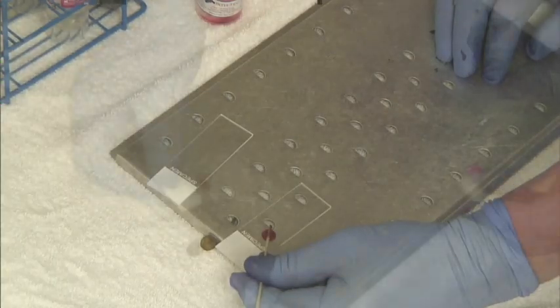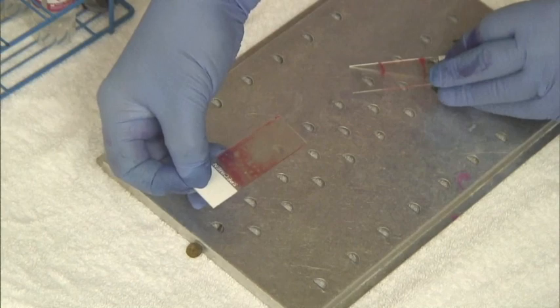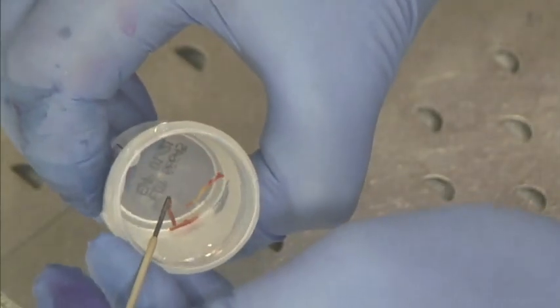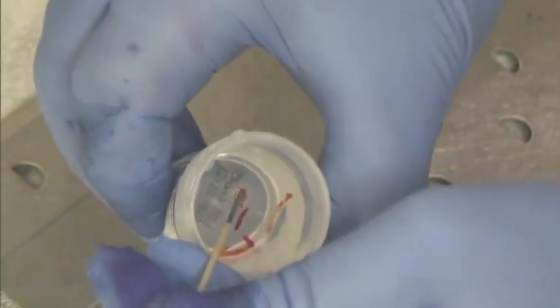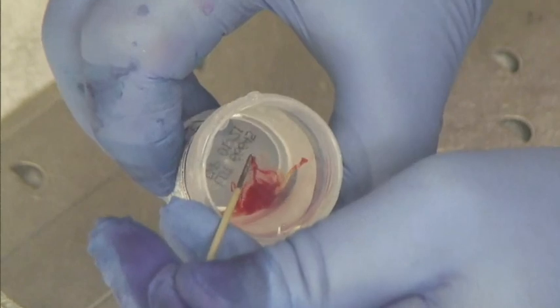A small amount of the FNB sample was prepared onto slides for rapid onsite evaluation. The remainder of the FNB sample was placed into a container containing formalin. Long pieces of core tissue were visualized.